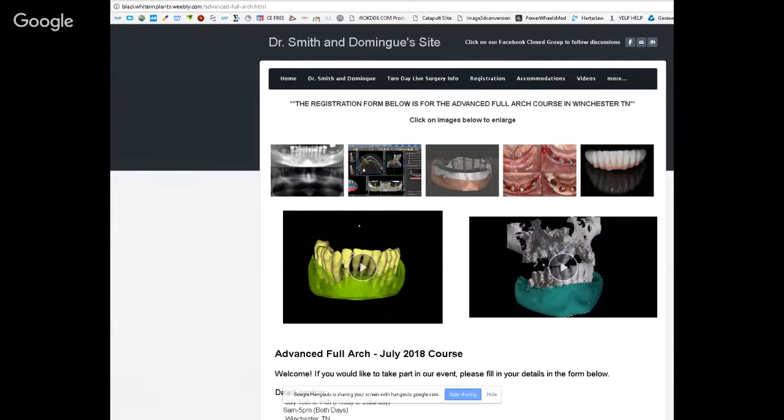I hope that answers your question. Thank you for asking. Okay. You talked about screwmentation, that you're in favor of it. Somebody asked exactly what you mean by that. You can actually Google it, but essentially it's called screwmentation. So you have screw retained custom abutments that are screwed into your implants, and your final crown and bridge work has screw access holes in it. So I cement those with permanent cement.